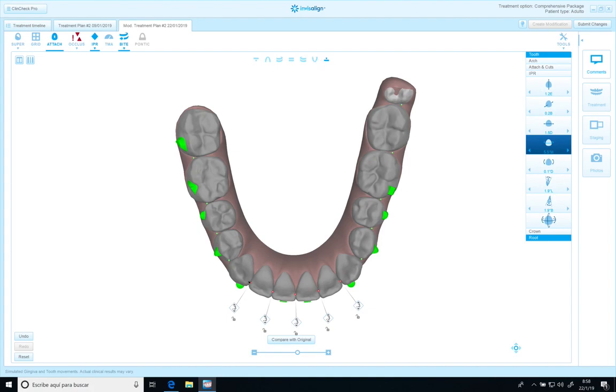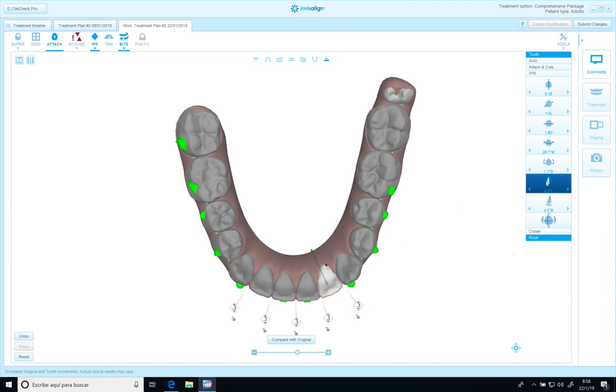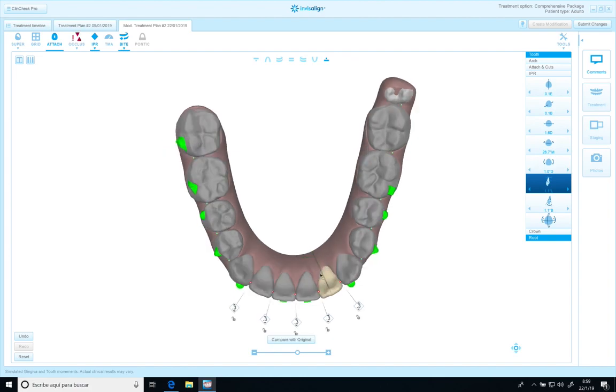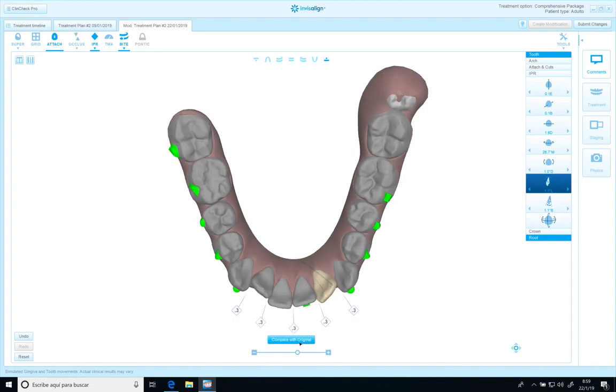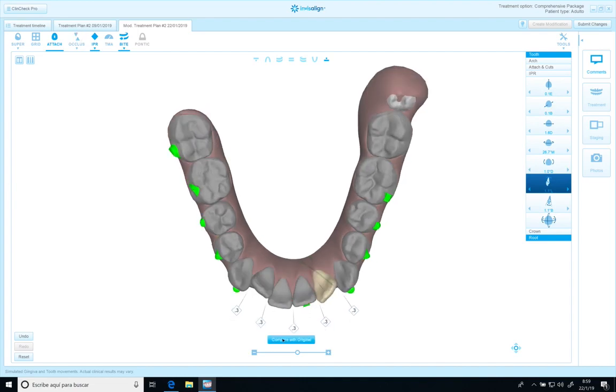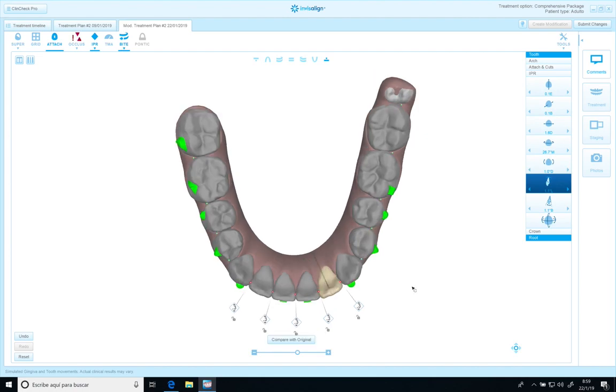In the lower arch, as you can see here, also the torque of the root is different. I want to increase the buccal root torque of this one because as you can see, the root is located through the lingual surface. So I'm going to tell them that while they rotate, they have to increase the buccal root torque here, and also a little bit here.